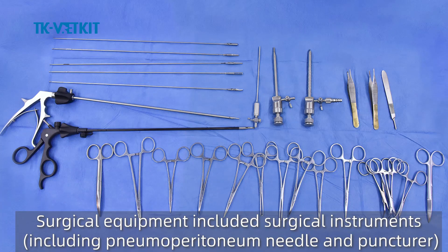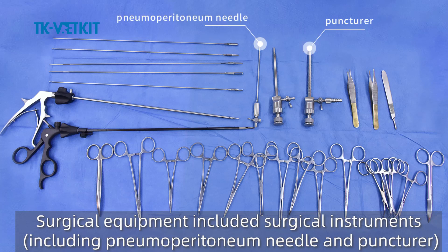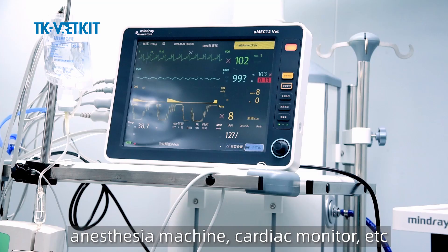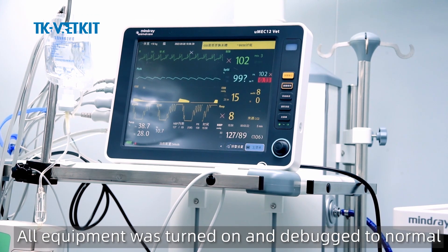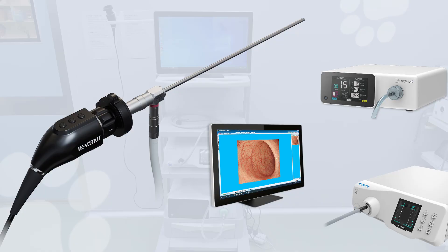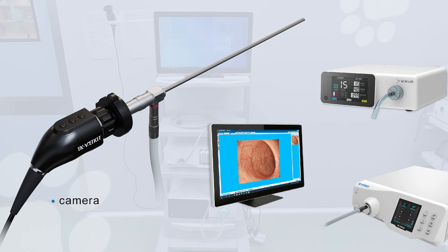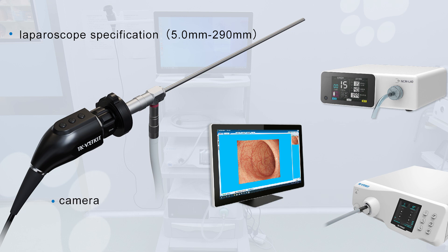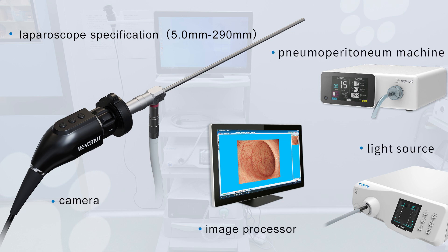Surgical equipment included surgical instruments including pneumoperitoneum needle and puncture trocar, laparoscope, ultrasonic knife, anesthesia machine, cardiac monitor, etc. All equipment was turned on and debugged to normal. This operation used the Juhi TK VetKit animal laparoscopy system, including camera, laparoscope with a specification of 5.0 mm outer diameter and 290 mm working length, image processor, light source, and pneumoperitoneum machine.